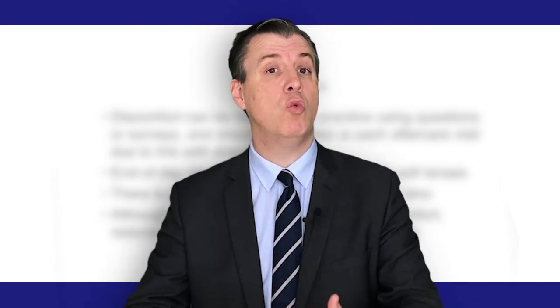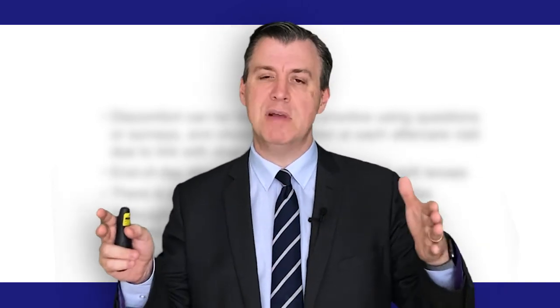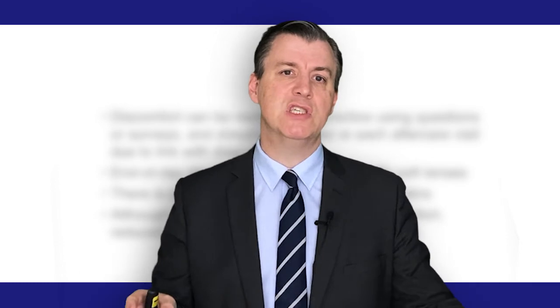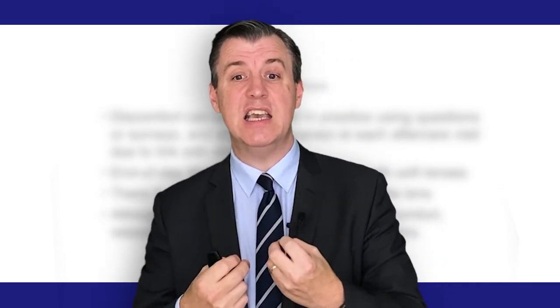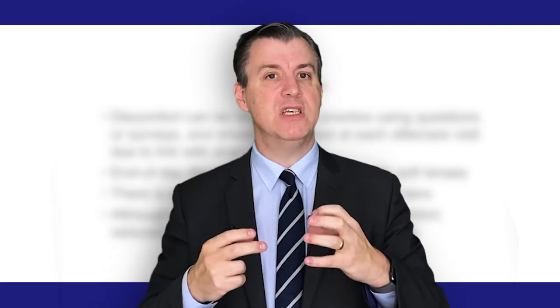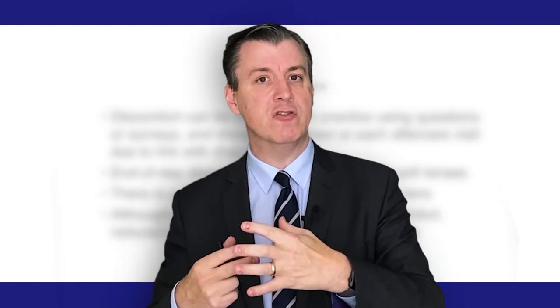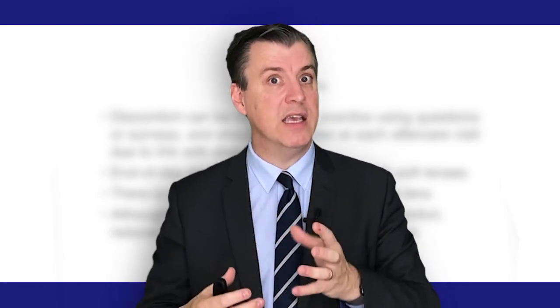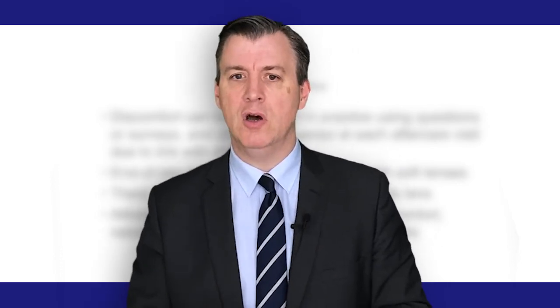Now specifically, the discomfort that we see with modern soft lenses is something that's happening towards the end of the day. Comfort through the early parts and deep into the middle of the day is usually pretty good, but we do see a noticeable and measurable drop-off towards the end of the day. This is the key feature that we're trying to address. Comfort studies where we've measured this suggest that it's not the lens that's changing through the day, there's something about the eye that is altering as the day goes on. So some clues there that I'll be picking up on later.